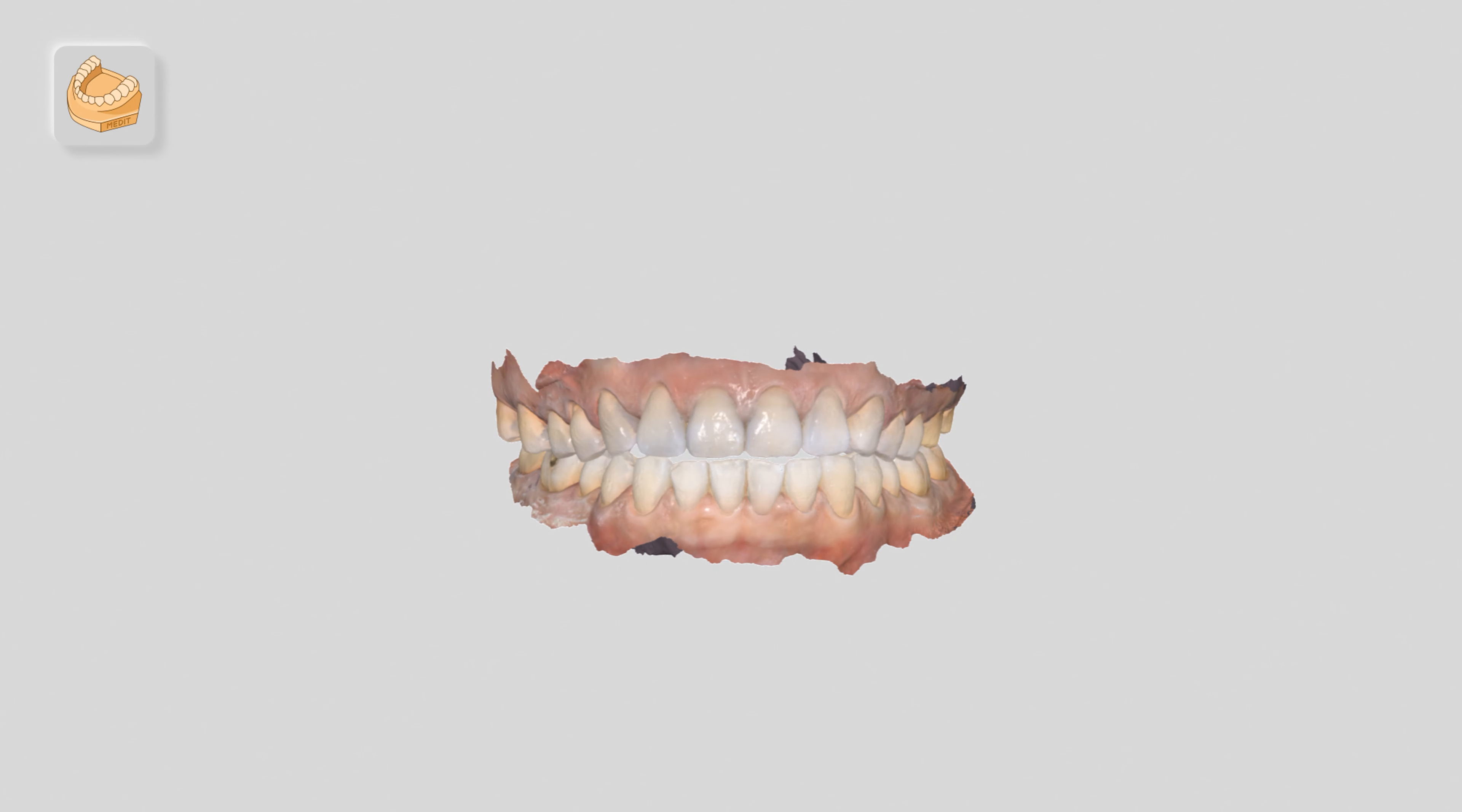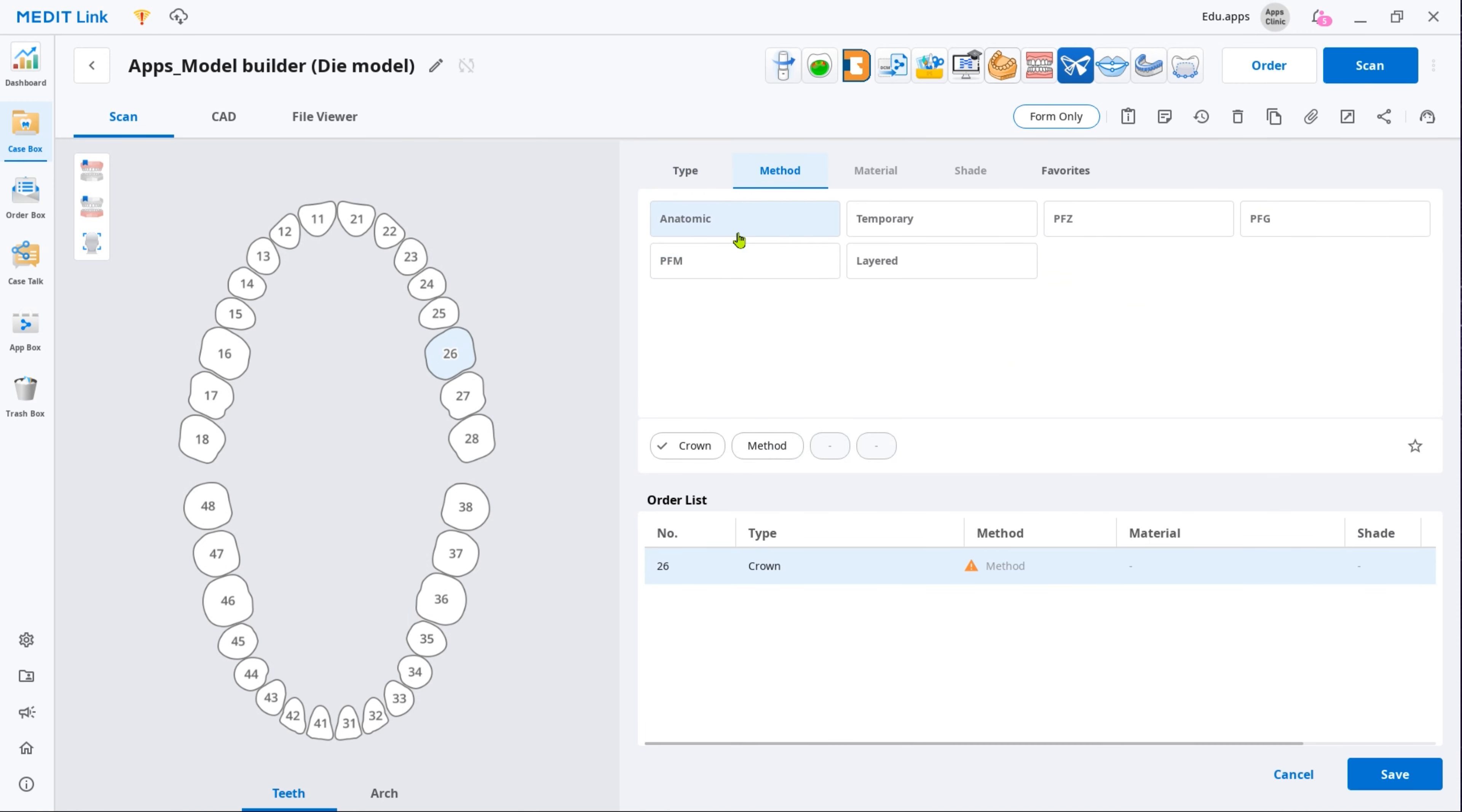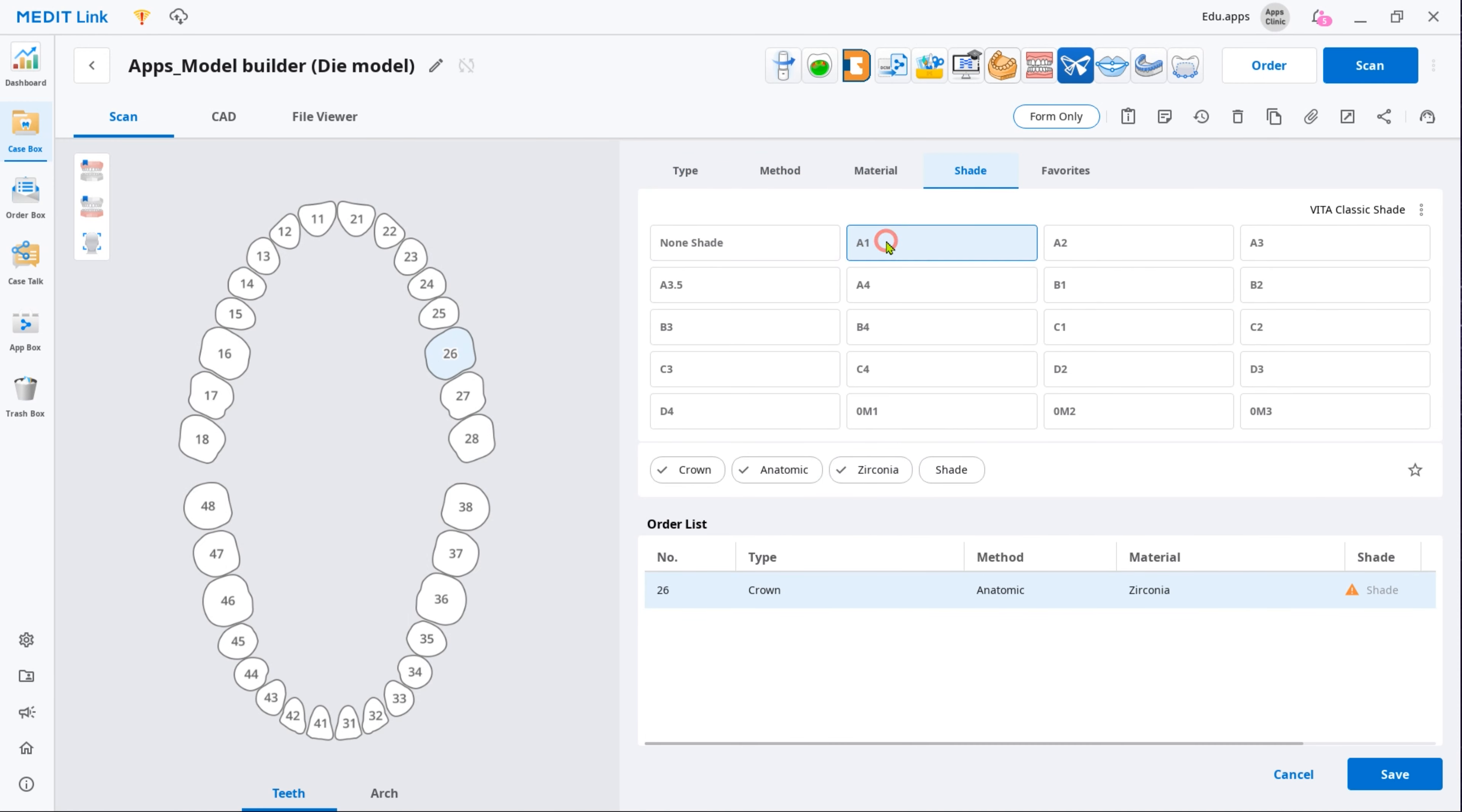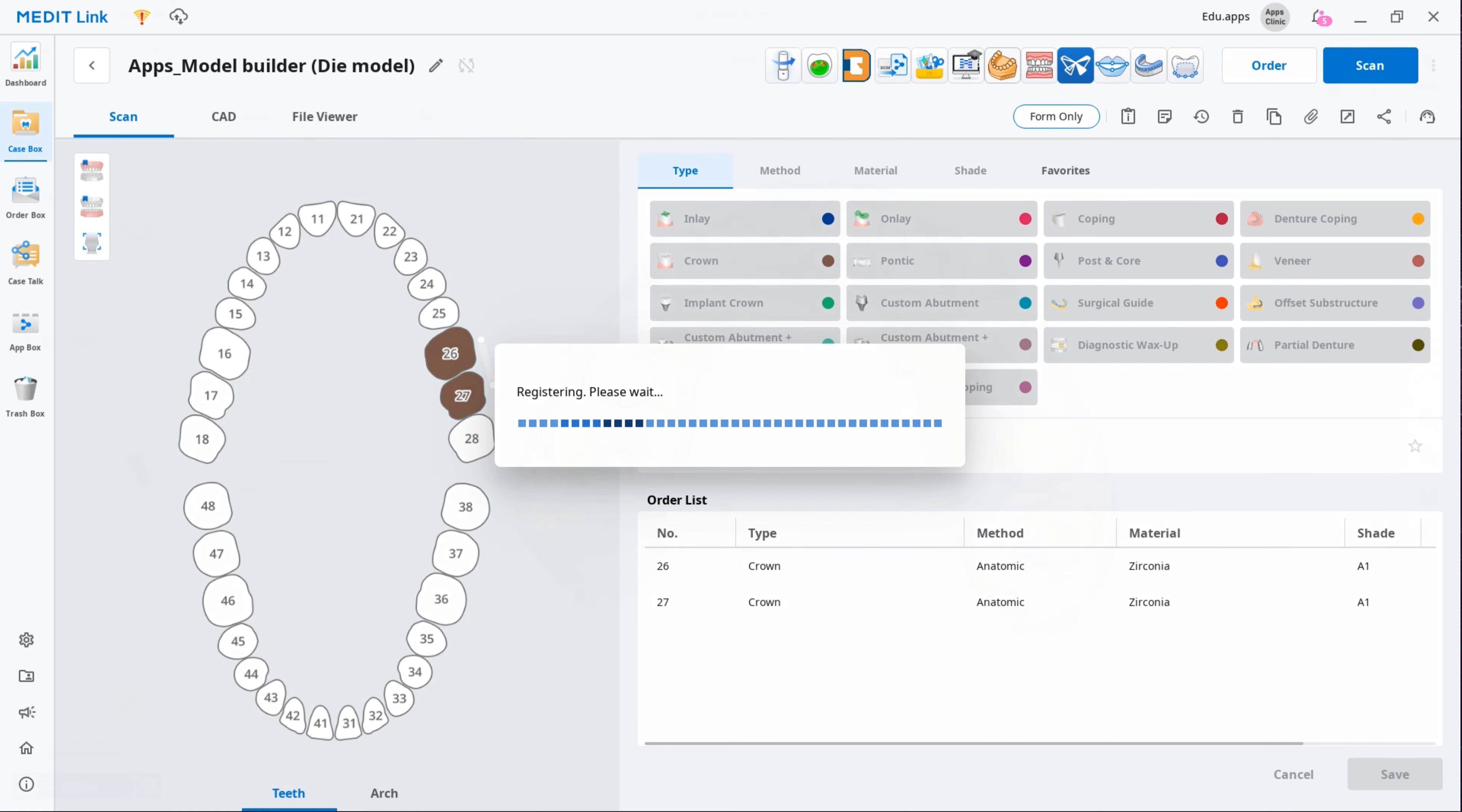You will need the scan data to work in the app. Create a new case, select Designated Restoration as product type in the form, and then scan both arches.